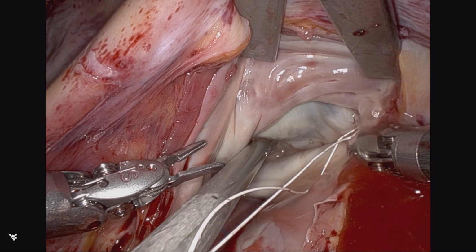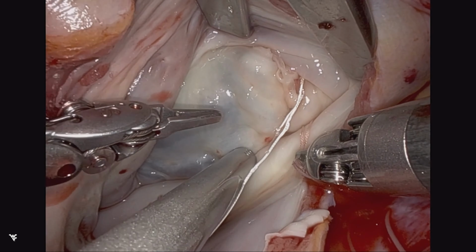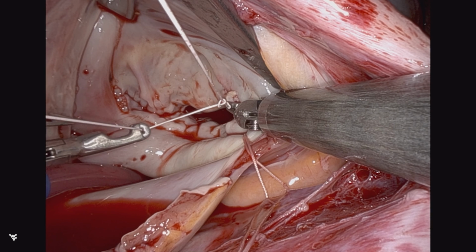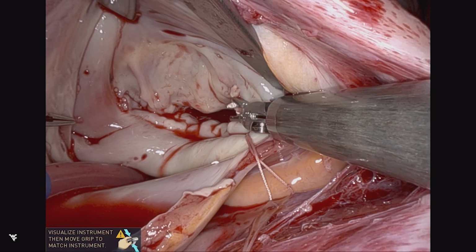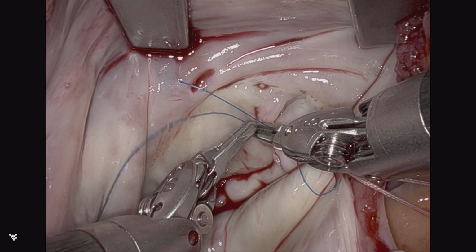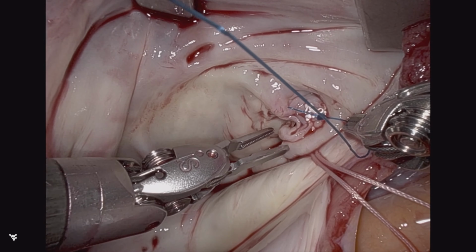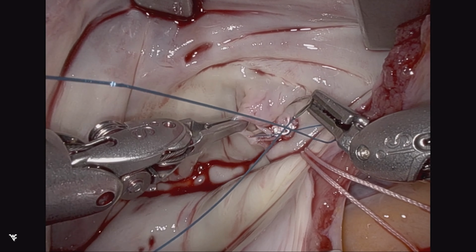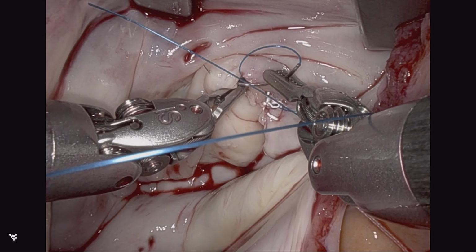And therefore, we elected to first reconstruct in a stepwise fashion that's lesion-specific. The most predominant is where the vegetation and chordal loss occurred at the commissure and extending into P3. Gore-Tex cord was placed, the knot towers secured, and then a reassessment. We can see on reassessment that there is a very large cleft between P3 and the beginning of A3 with some tissue loss.